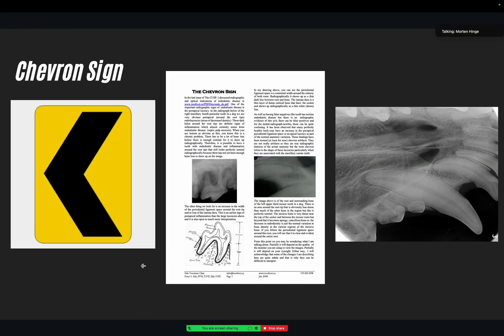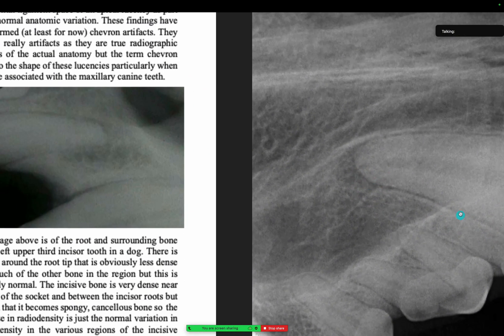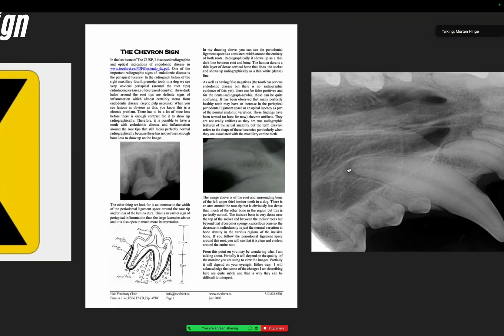This can be pretty confusing because when you look at this incisor, you see that nice periodontal ligament space here, but then you look at the canine tooth and the periodontal ligament space is nice here, and then it stops and there's this area of darkness and you think, okay, this must be a tooth abscess.